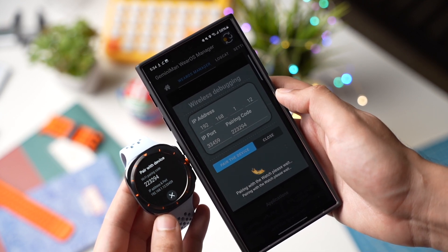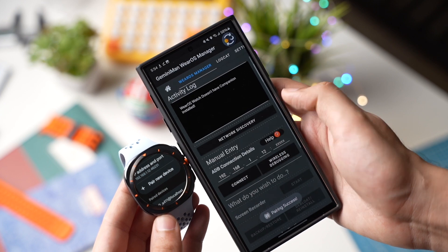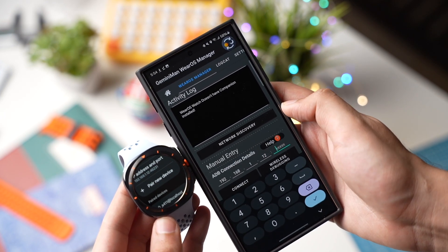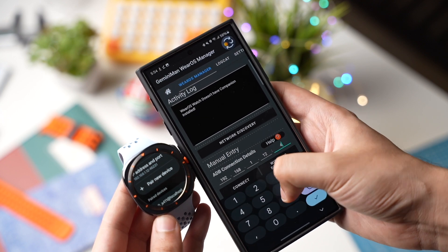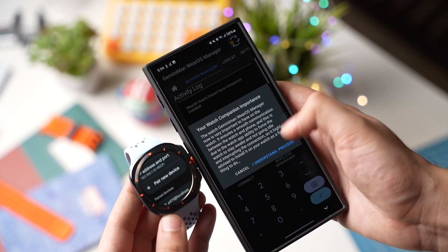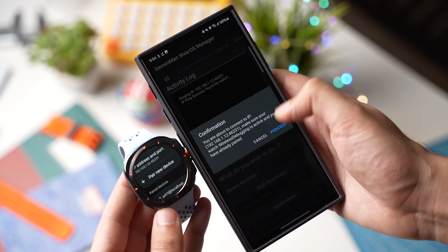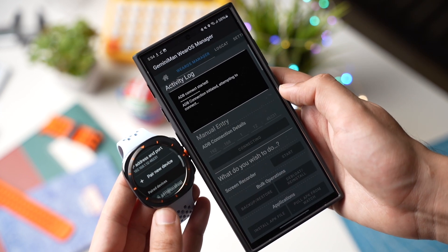Once you have entered that information, under ADB Connection Details enter these numbers right here and tap on Connect. Now your watch is connected to your phone via Wi-Fi.